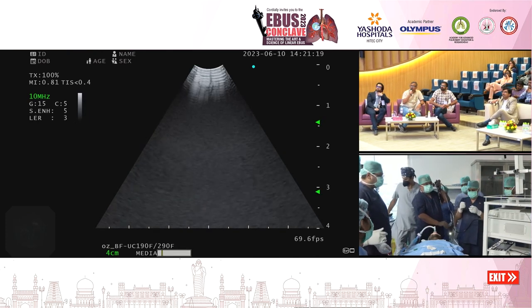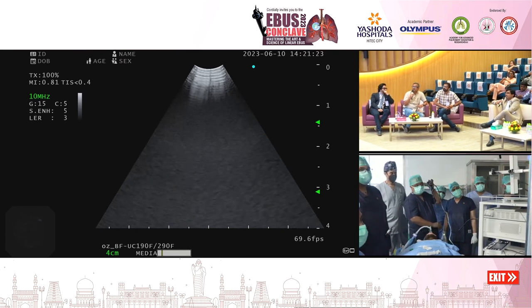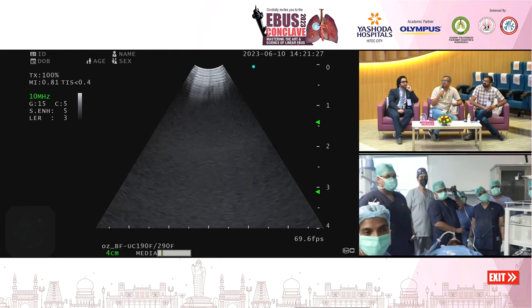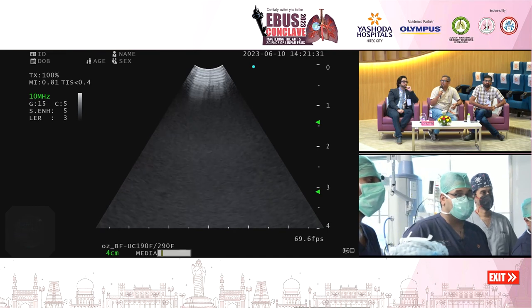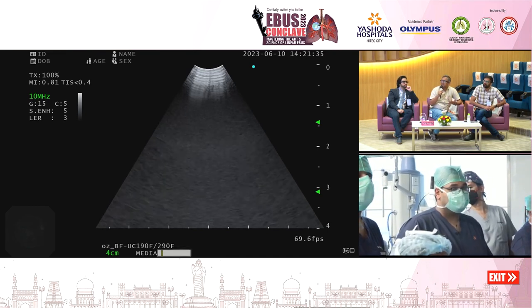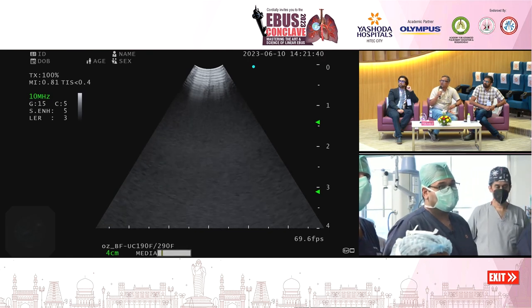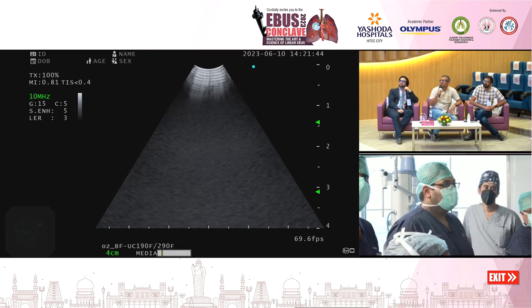Okay, Pratip, just a question here. Now, this is a case where it's a 29-year-old male, he has loss of weight, loss of appetite. Yes. My top three differentials would be definitely granulomatous, either sarcoid or TB. And of course, I'd keep lymphoma in mind. Yes. So, where would you start? I mean, every single station that you showed us, you said it's enlarged. Yes. So, do you want to start on the right side? Do you want to start on the left side? Do you want to just sample the subcarinal? What would your approach be in such a situation?